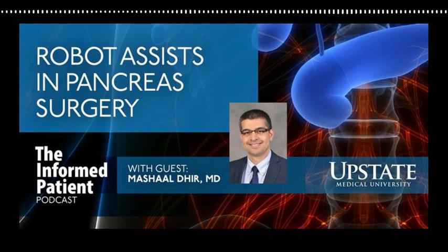Do patients make the decision if they want open or robotic, or is that something that you tell them what will work? I think it's a collaborative decision. Ultimately, we discuss both with the patients if they are candidates, and I think it is unusual for patients to choose open over robotic. But yeah, most of the times we offer this open based on the challenges posed by the tumor itself. But for patients who are candidates, they are readily agreeable to getting this done robotic.